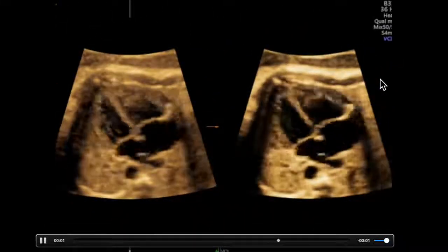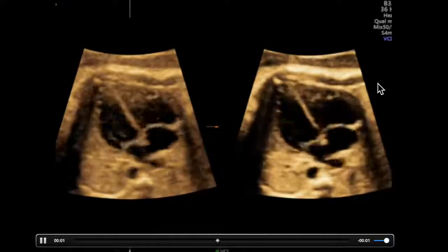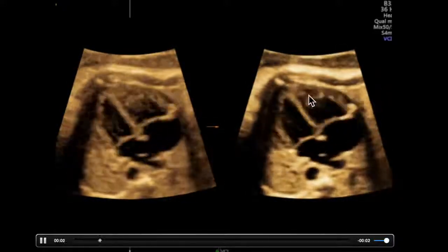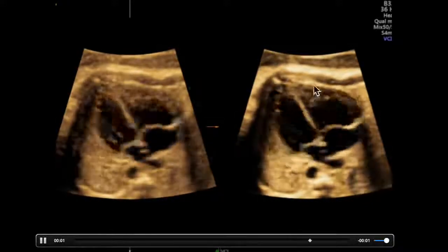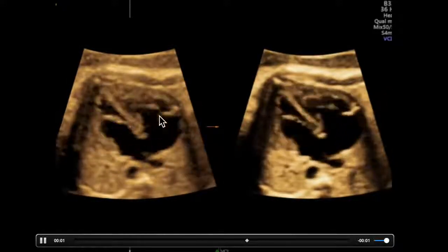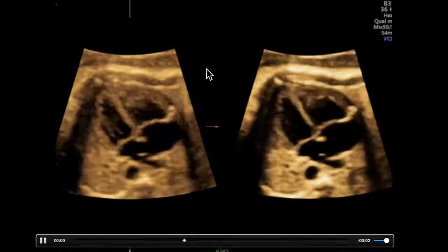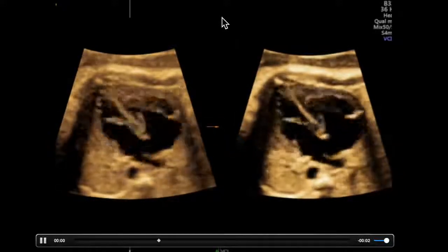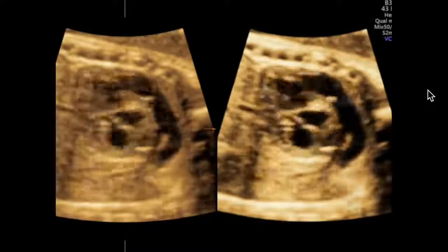Here are some side-by-side examples of really small slice thicknesses to show the delineation of the contrast, valve motion, myocardial movement, et cetera, superior to the 2D image. Now, you don't have to do these side by side. You can image VCI-A as just a single screen, but most of these are done side by side just to provide some contrast for you.